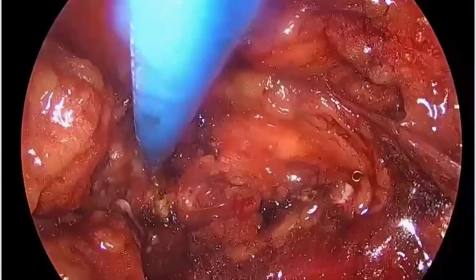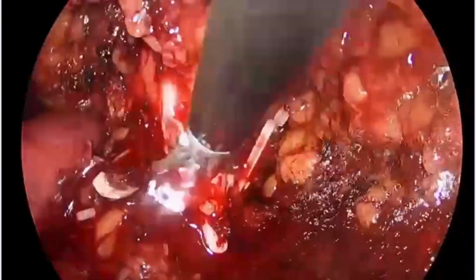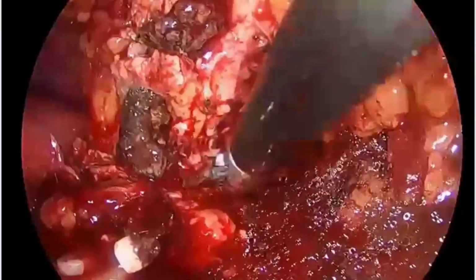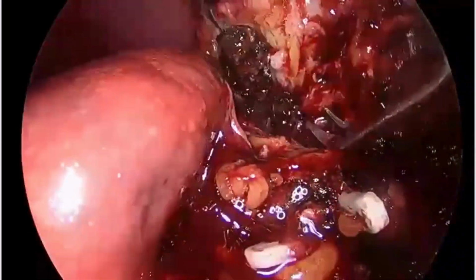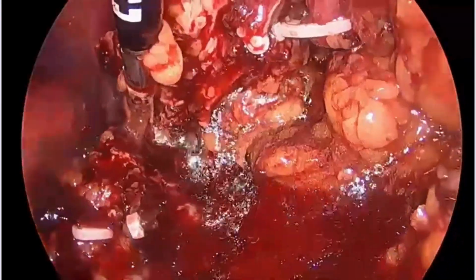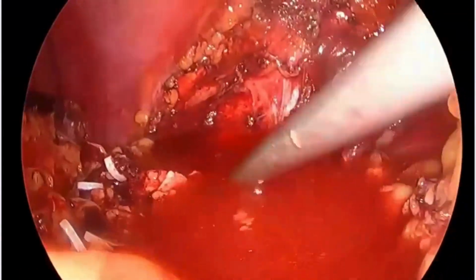So we could dissect the posterior convex surface of the kidney from the abdominal wall to release it from those adhesions. And once we decided that ligature is not going to help anymore, we used scissors liberally around the renal pelvis, and in fact we had to cut some tissue of the renal pelvis just to make sure that whatever kidney we could remove. And in attempt of removing the kidney with the help of scissors, we opened up the pelvis, we removed a few stones, and finally we could remove the specimen almost completely. And once the specimen was removed, a thorough wash was given, ensuring no more bleeding.